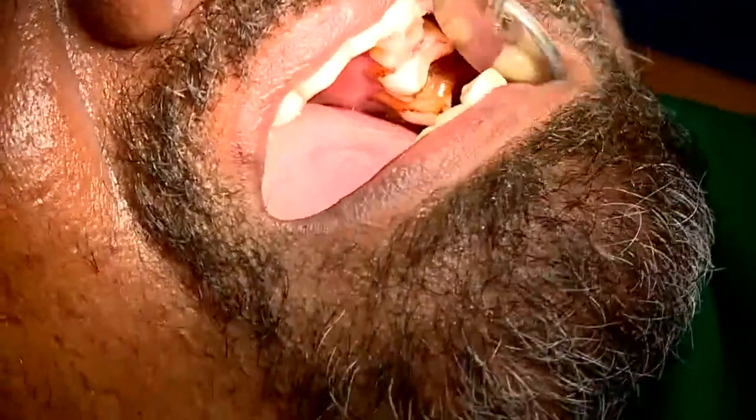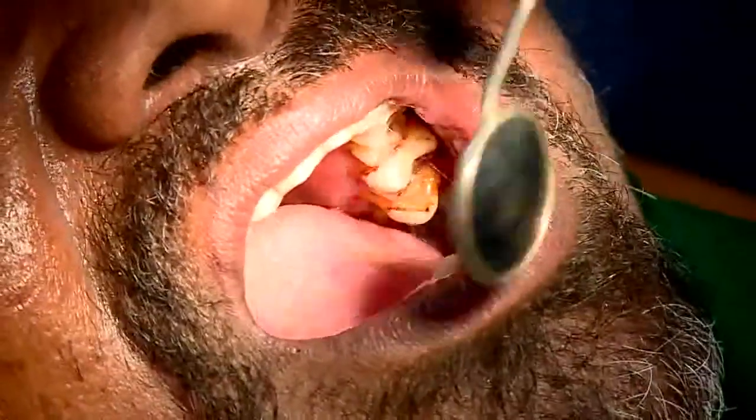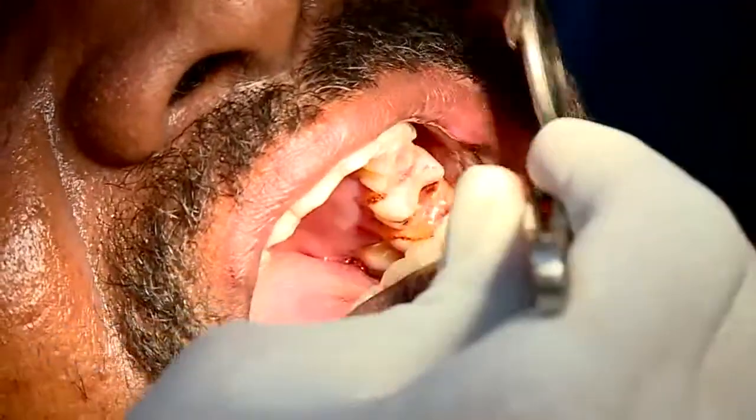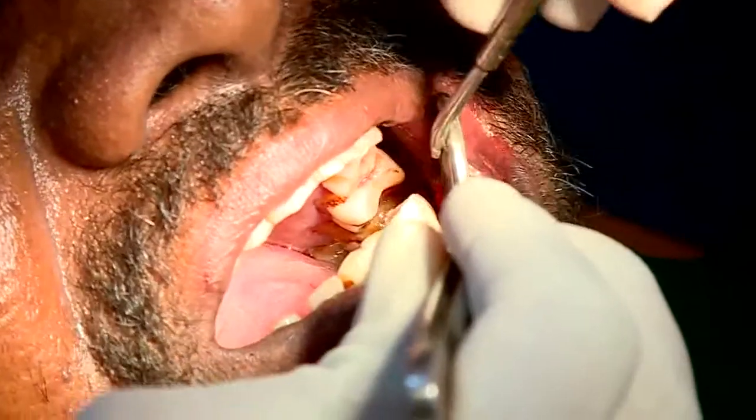So we have passed a single suture on the normal side of the mucosa, so the biopsy site is a little approximated. Outer side is totally closed. I cannot close it totally because the rest of the area is a lesion. I don't want to pass the needle through the lesion area. So that marks the end of the biopsy procedure here.